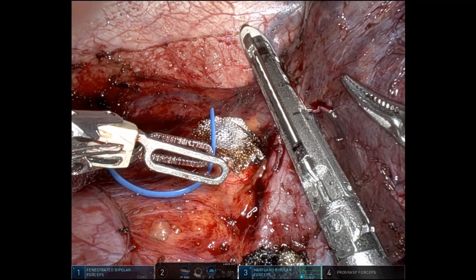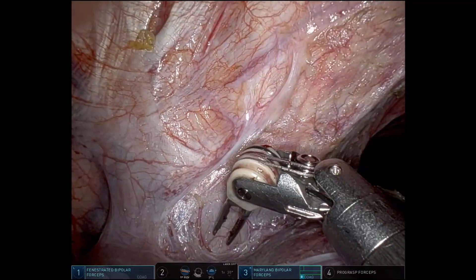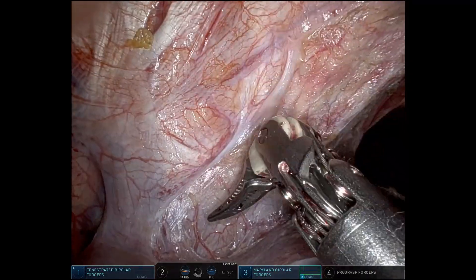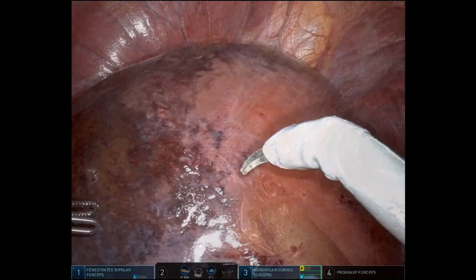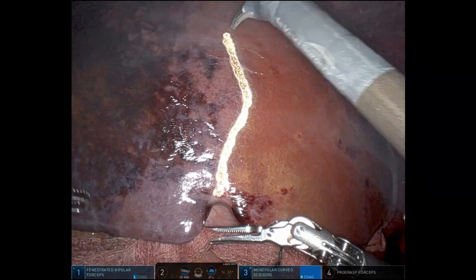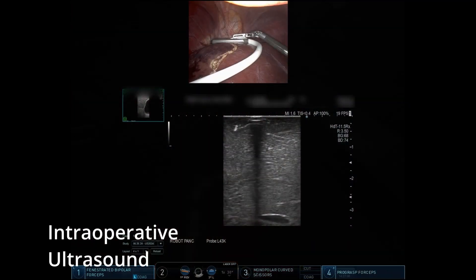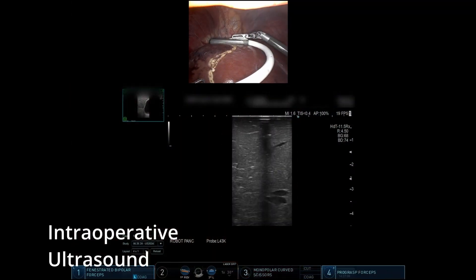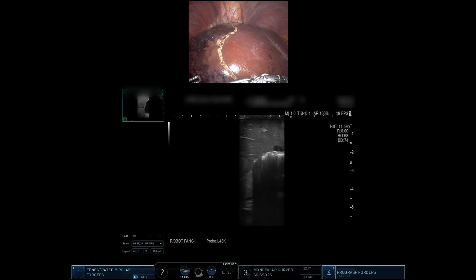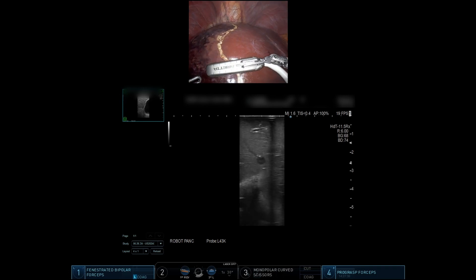We will divide the right hepatic vein at the end of the case, but you can see the space there. Here we finish developing this space between the right and the middle. Clear demarcation of the liver, you can see. Using ultrasound to confirm — you can see the posterior shadowing of our score mark and its relationship to the middle vein, which is what we're evaluating here.